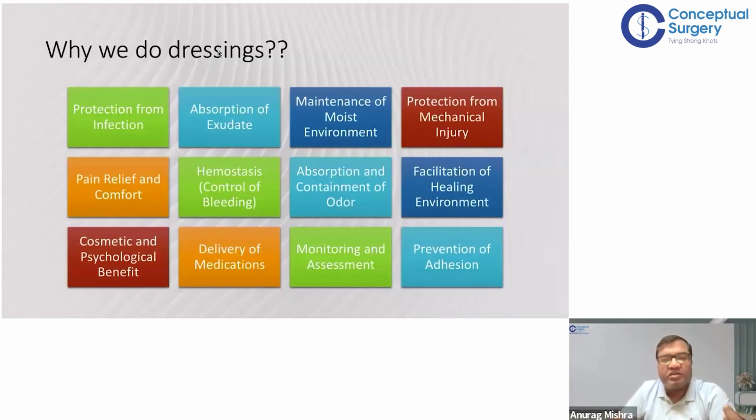Now the question comes, we should understand why we are doing dressing. What is the purpose of dressing the wound? We can leave it open also. So the dressing is done, first and foremost, to protect from infection. We know the skin is a very good barrier against infections. So if the skin is lost and the wound is open, the wound is susceptible to infection from outside air. It can come in contact with clothes, with other things or surrounding objects. So the infection can transfer to the wound very fast. That's why dressing has to be done.